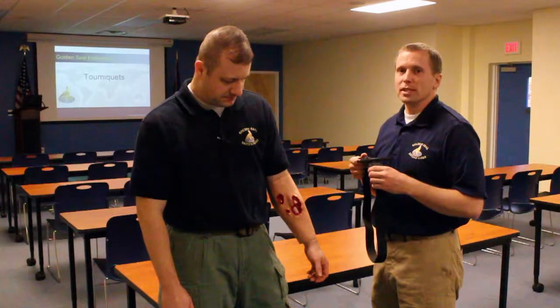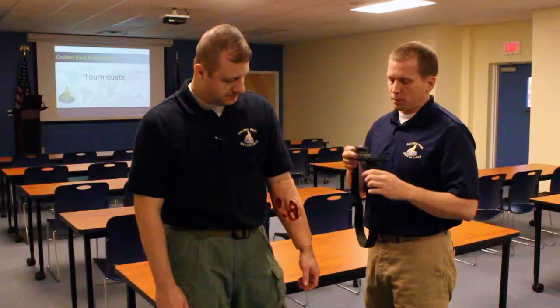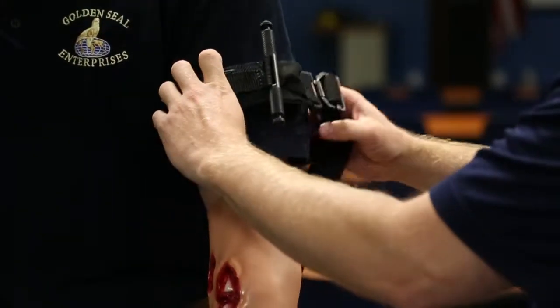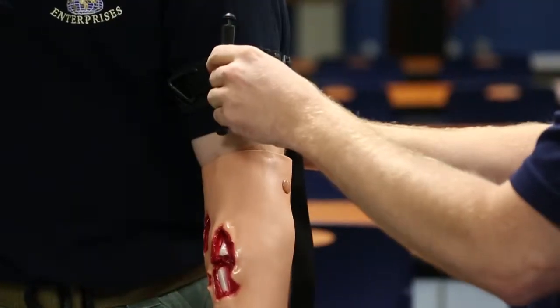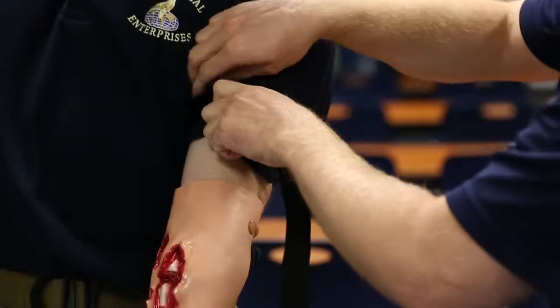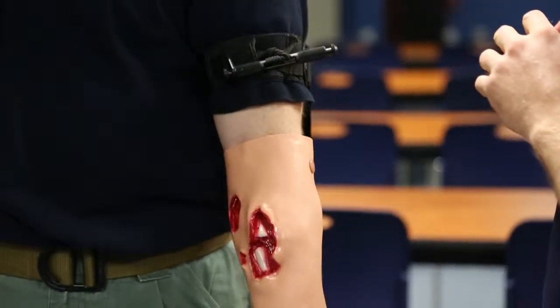Therefore, an individual needs to assist that person in order to control the hemorrhage occurring on the arm or the leg. The principles of application are the same — the constricting band needs to go around the arm or leg above the wound. Once placed above the wound, the constricting band can be tightened up and then the windlass can be turned in order to gain mechanical advantage and stop the bleeding. It can then be locked in place so that you can remove your hands and it will control the hemorrhage.